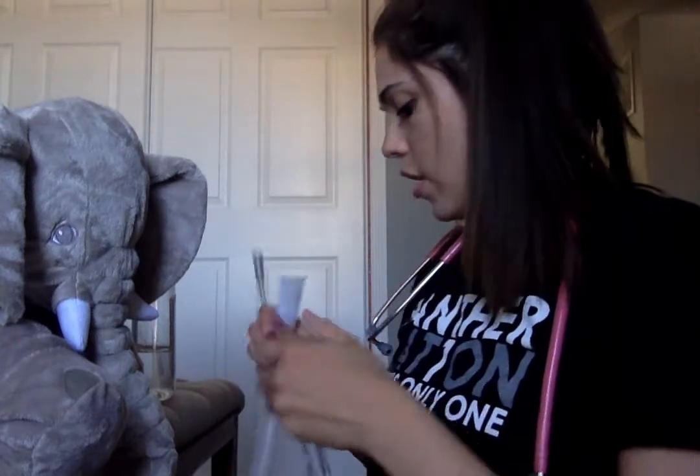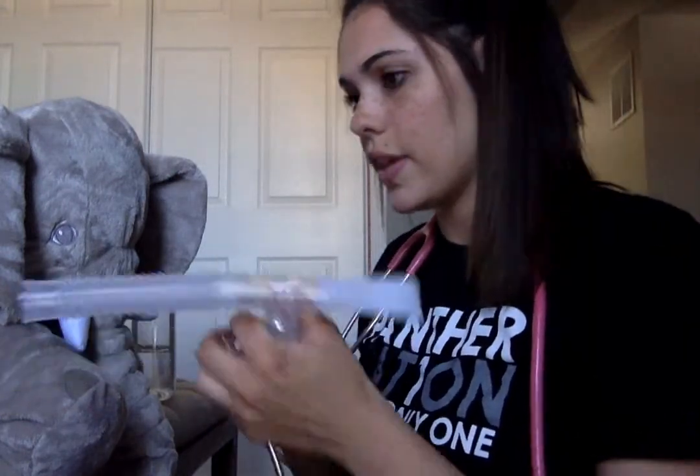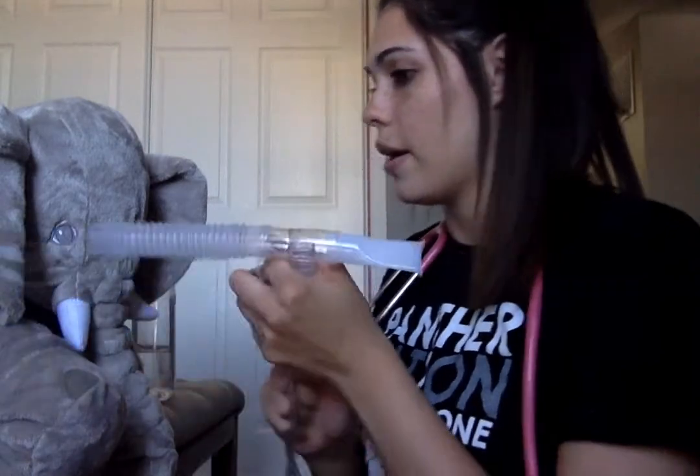Alrighty, so we're going to be administering you 3 different types of medications today. So the first one is Duoneb, and this is a mixture of albuterol and ipratropium bromide. And we are going to be doing this through a small volume nebulizer, and this is going to be 4 times a day. So with this medication, there are some side effects, and these can include headache, dry mouth, or you can begin to feel nauseated. So let me know if you experience any of those.